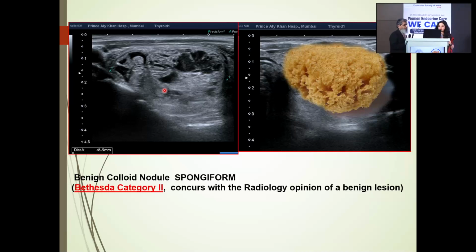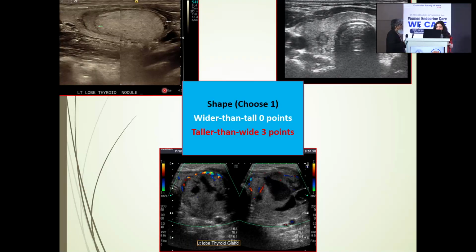These are the thyroid's descriptors, but I thought we should make it very simple and make you understand. This is a very nice, benign looking nodule, which is hyperechoic. This part is a little bit isoechoic, and this is the rest of the remaining thyroid parenchyma, and that is the perilesional halo. If I were to add color here, it would show vascularity all around this.